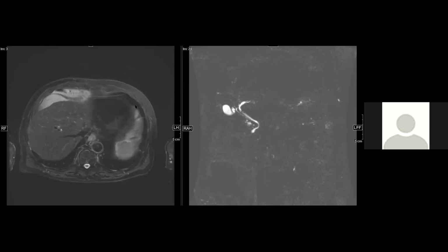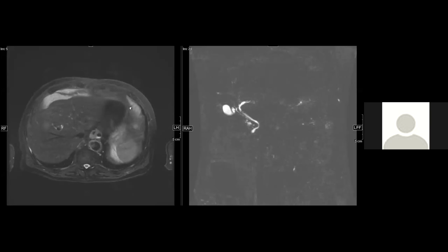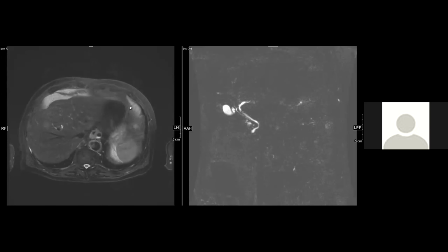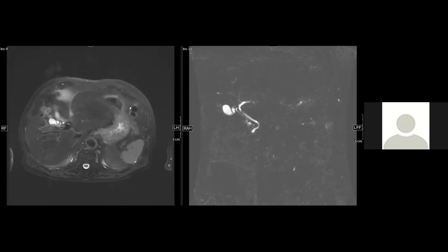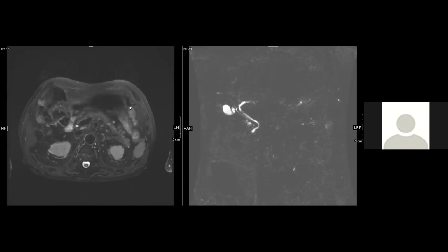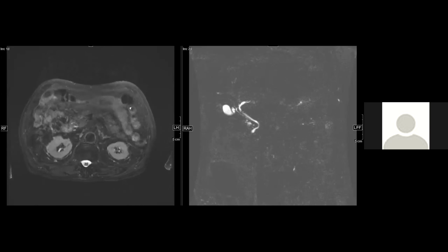Yes. So this was a female who presented with long-standing jaundice. We did an ultrasound and CT before, but it was negative. I'll scroll through the images. It's just a show and tell case. I've never seen a case like this before, so I thought I'd share it with everyone. I don't know how common or uncommon it is in clinical practice. So the presenting symptom was jaundice.